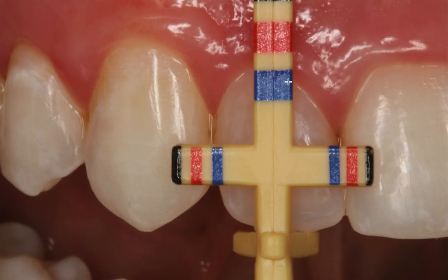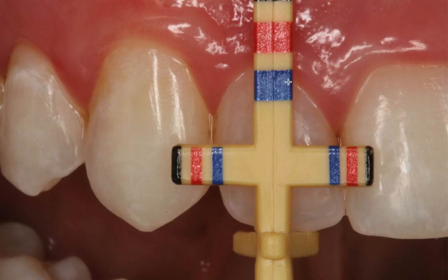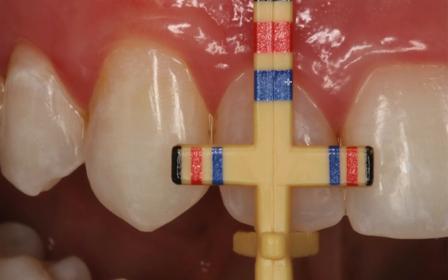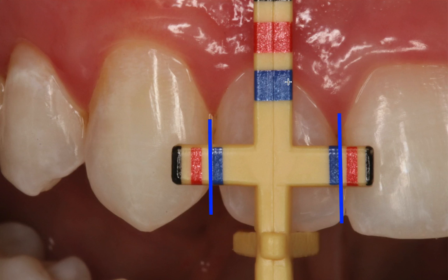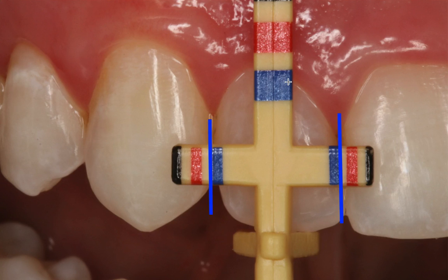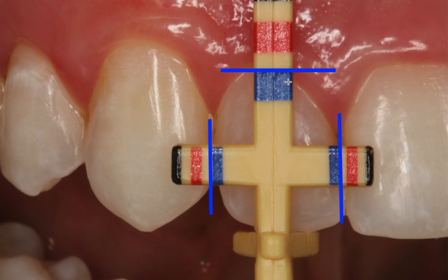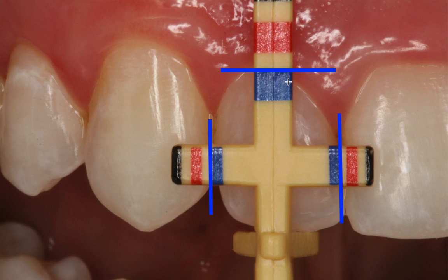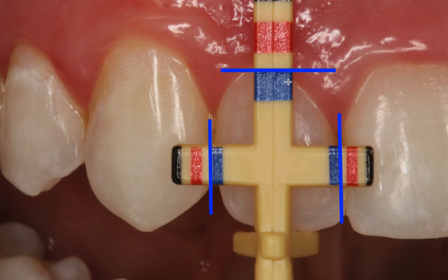Looking at the lateral incisor, according to the proportion gauge, the proportions are correct. The tooth is as wide as the blue lines and it's as long as the blue lines. So in terms of proportion, it's actually correct.